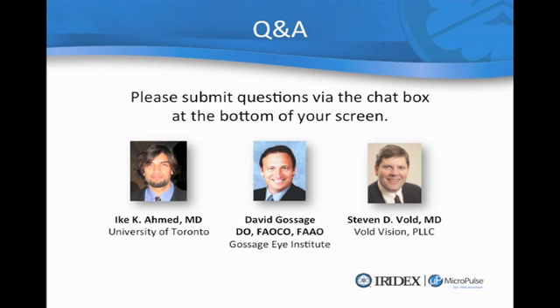I will tell you one other thing for me, and this is a caveat for people that have pseudoexfoliative glaucoma or exfoliative glaucoma. For me, I'm telling you, laser trabeculoplasty is a fantastic first choice, and in many patients, I will actually recommend that as initial therapy. Yeah, I agree with Steve wholeheartedly.